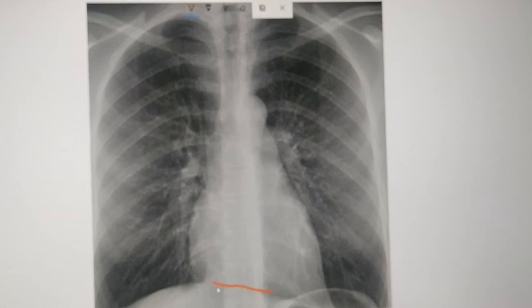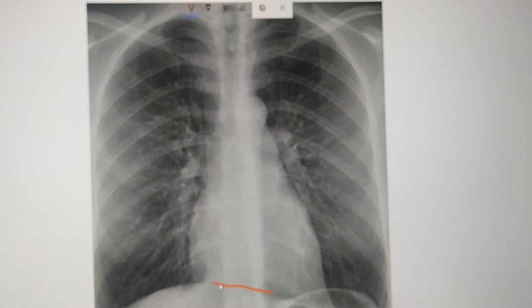Hello, today I am going to talk on the heart border on chest X-ray — specifically which structures form the heart border on chest X-ray PA view.